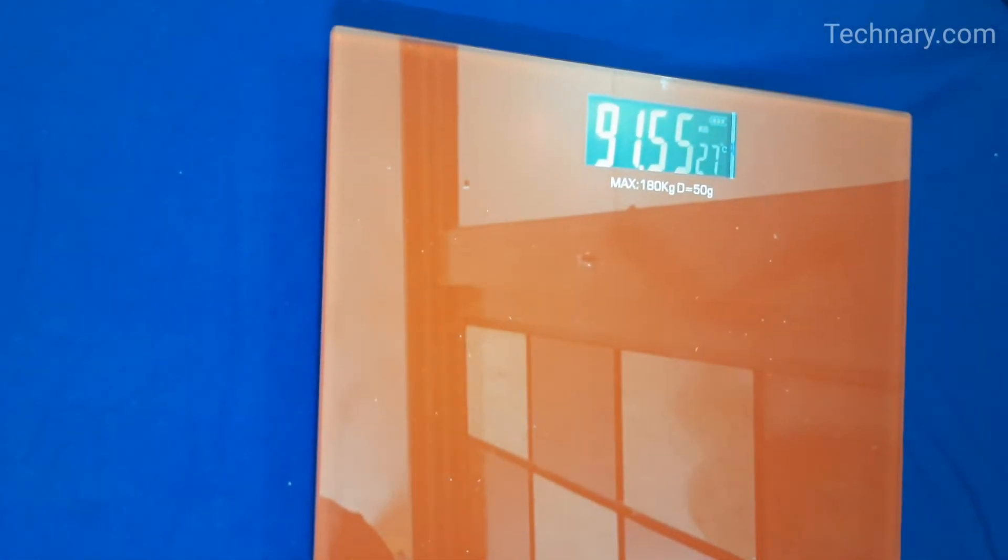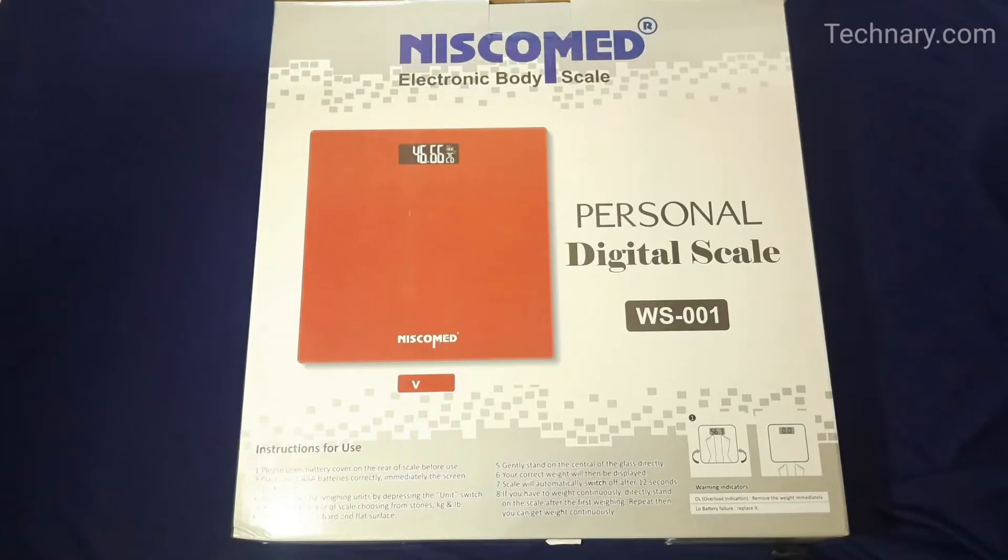It's showing my weight which is 91.55 kg. With this scale it's very convenient to check my weight at any time. If you are looking for a good electronic body scale then you must buy this Niscomed personal digital scale and its model name is WS-001.